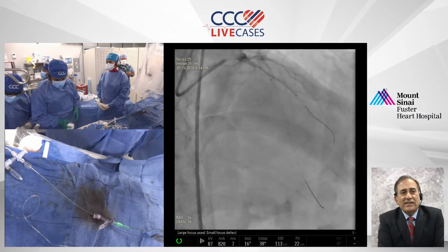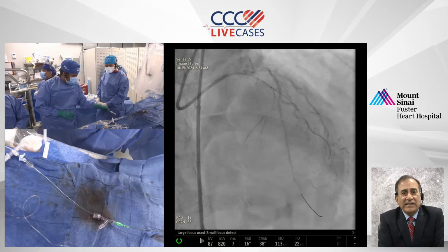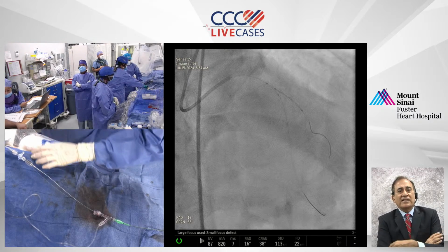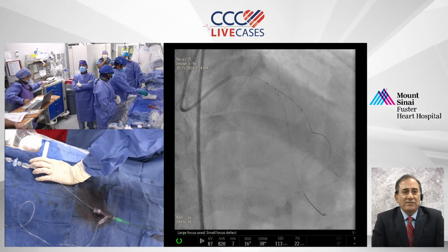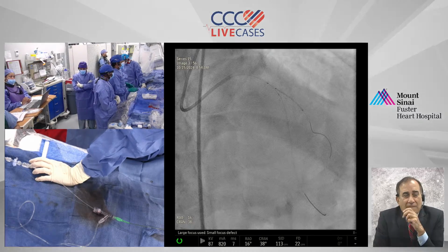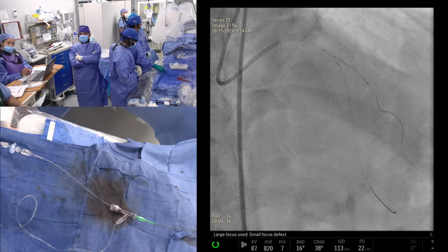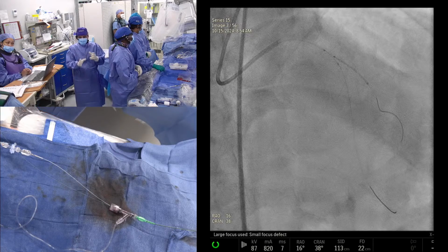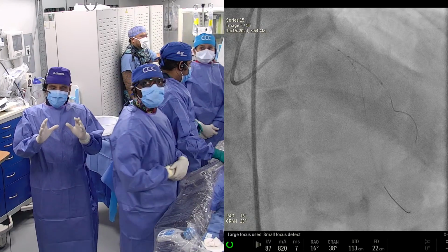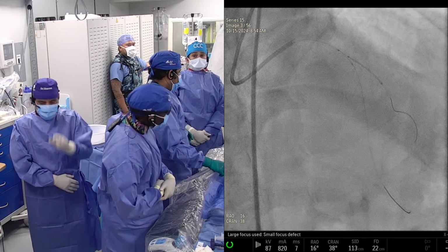Now, the specific question I have for you is, why does a post-STEMI additional non-culprit lesion, on the basis of flow, again, it's not surprising, but why is it so different than the FAME 2 population, where FFR had such a big role? Yeah, so I think basically what happened is, people have said also that many times the FFR changes in these patients when you bring them in at 3 to 6 months because of the various vasoactive tone. So the question basically comes down to that angiogram, and this is again the lesion which has to be like 60 to 90%. The CTO were not part of it.